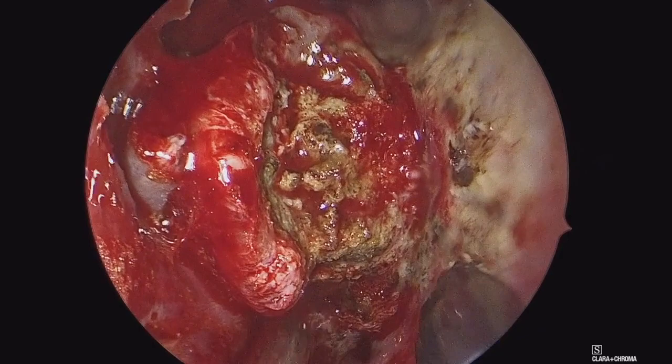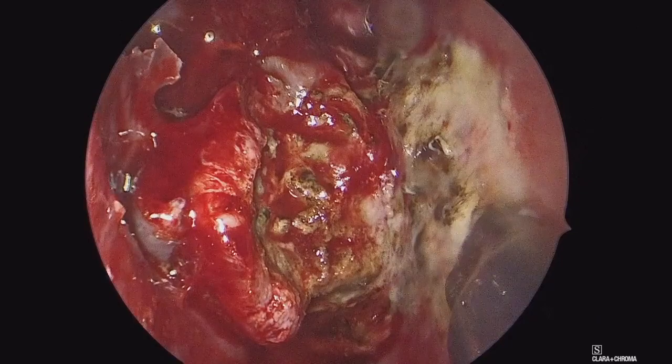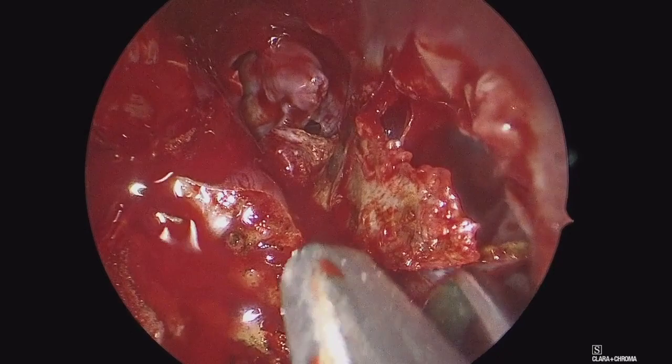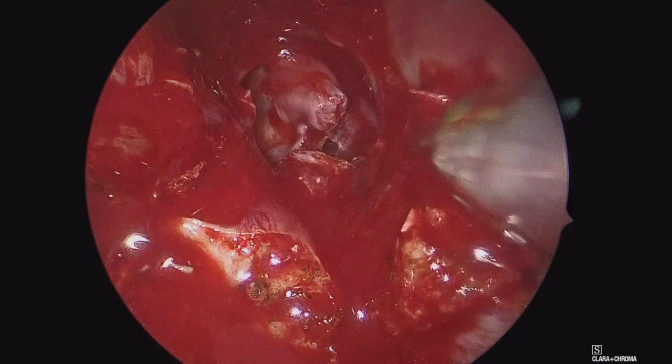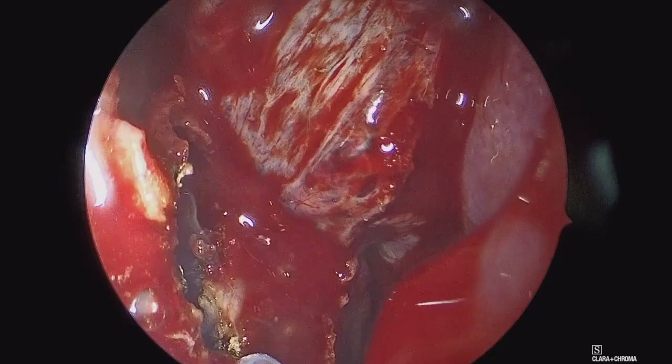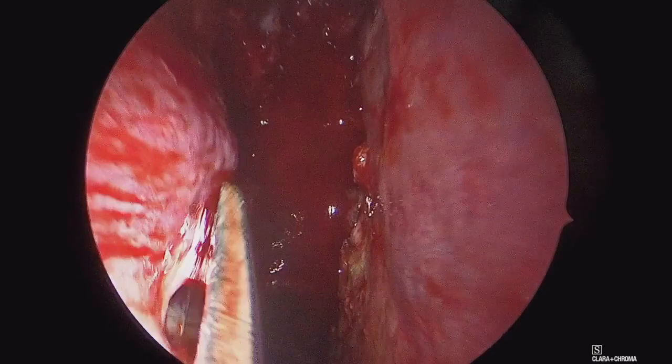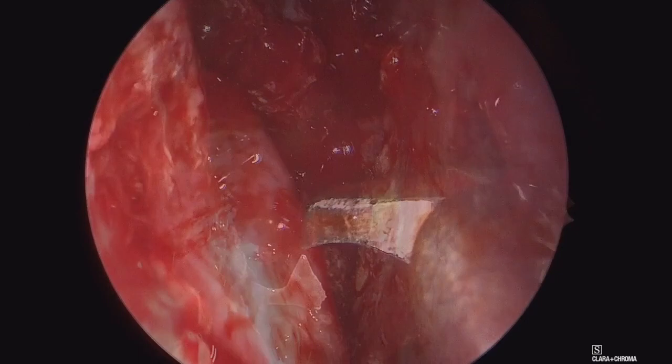Here we are using a cautery device with a plasma field that allows us to sequentially cauterize the tumor as we work around it. We are at the remaining portion of the right posterior septum, noting that we've raised a contralateral septal flap such that the pedicle is not damaged during this dissection. Then accessing that posterior septum and coming across midline. Here we're removing the most inferior portion of the nasal septum below the tumor, allowing a better port for egressive blood as well as access to the tumor. At this juncture, we'll proceed with our right-sided endoscopic medial maxillectomy, removing the inferior turbinate and the entire medial wall of the maxillary sinus down to the nasal cavity floor.